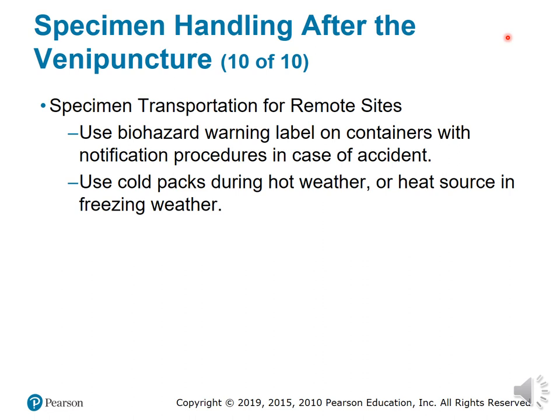Once we pack it off, we have to pack it off at least in 3 different containers so it doesn't spill, it doesn't turn sideways, that it stays in an upright position at all times, and that the specimen is protected from any elements, be it rain, sleet, snow, or hail, or hot weather in the south. And also, God forbid, if the driver gets in an accident or the plane crashes, because most of this goes out by plane, guess what? That sample is still protected because of how many times we packed it down in order to ship it.